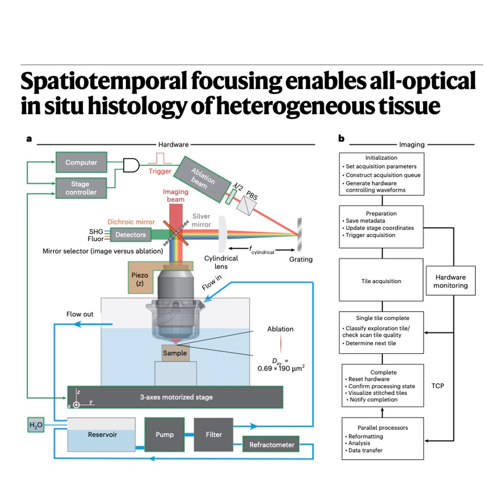Exactly. It follows a core 4-step workflow loop for each layer. Explore, scan, analyze, ablate. Over and over. Okay, what happens in each step? Explore sounds like a quick look. Yeah, Explore is a rapid, low-resolution surface imaging pass, just to get the lay of the land for that layer and define the specific region of interest, the ROI, that needs high-res imaging and ablation. Then scan is the detailed picture.